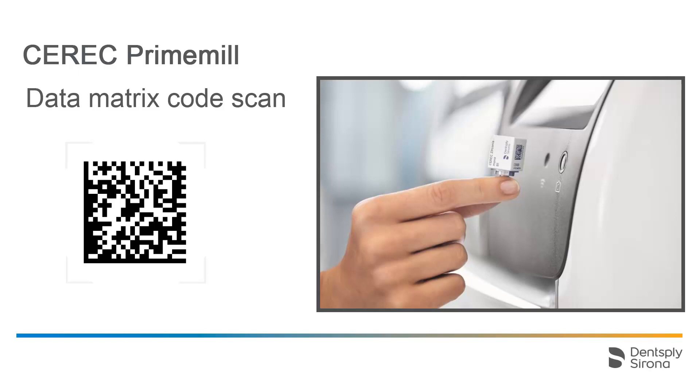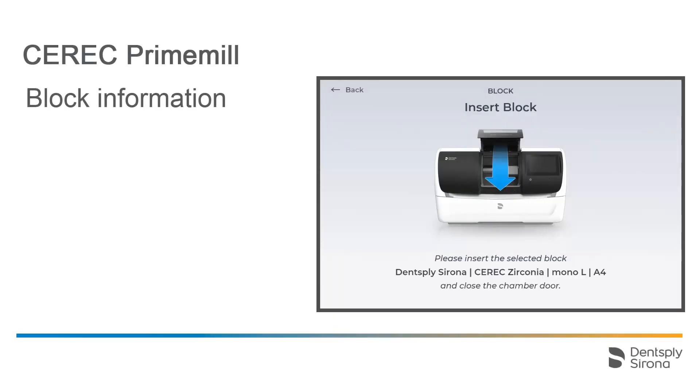For blocks without a data matrix code, the scan function on the touch interface can be skipped. Instead, manually select the manufacturer and block type from the database. After the scan is complete, the block information will be displayed on the touch interface. We will now show you a short video to illustrate this process.